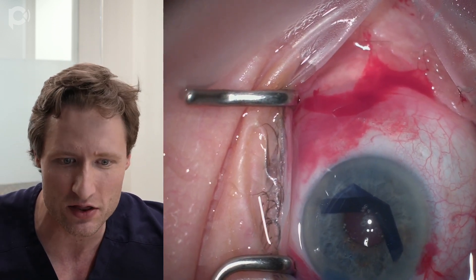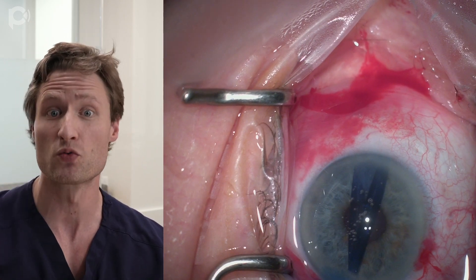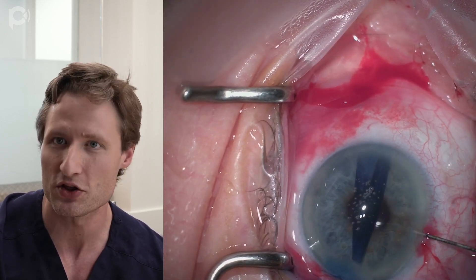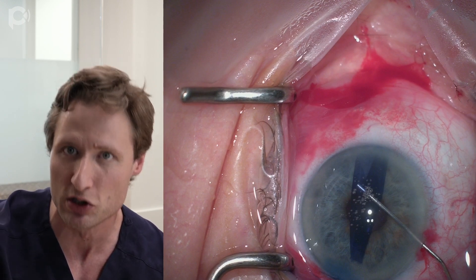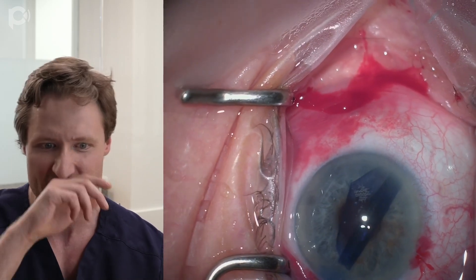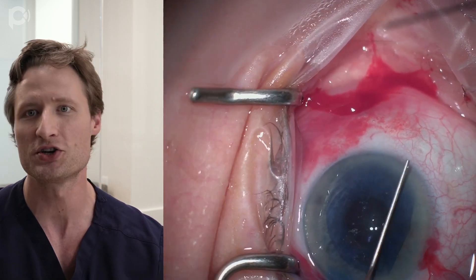The graft is in the eye. I inject a little saline just to get the graft to perk up and open so I can see what's going on. The graft is curled, floating in the center of the eye, and it looks to be right side up — double scrolled. Through a paracentesis, I check the Moturo sign, sneaking the cannula in to engage with the edge of the graft. The cannula comes back blue, confirming the graft is right side up. I shallow the anterior chamber, place a few taps on the corneal surface, and use the Durasomer technique to open up the edge — and it's totally unfolded.